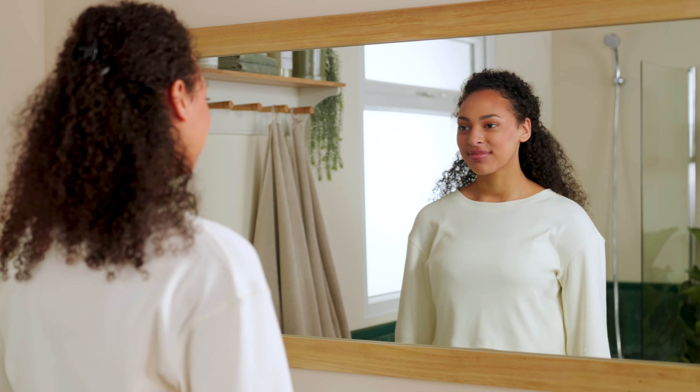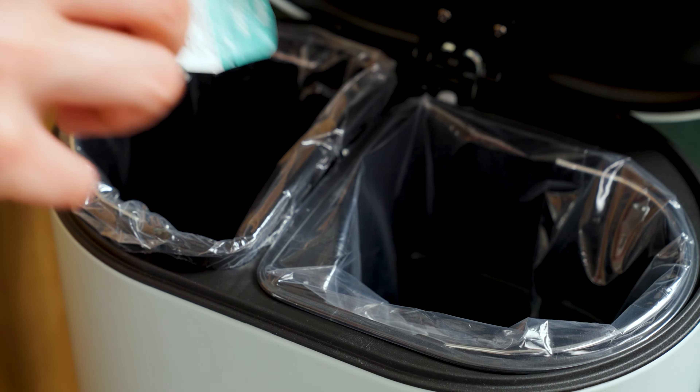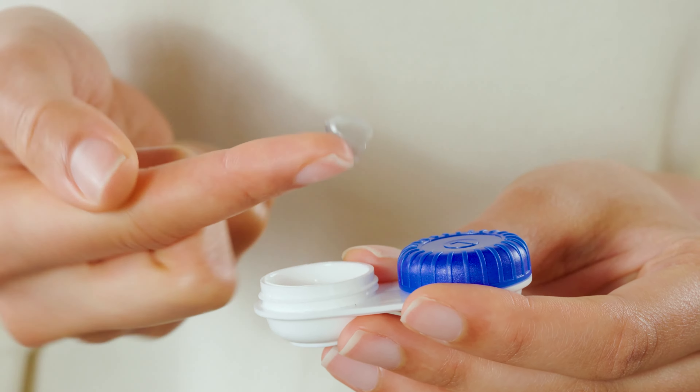Contact lenses usually work really well, but from time to time they may feel uncomfortable or gritty, which can be annoying. If so, there are a few things you can do. If you're using daily disposables, it's best just to throw the lens away and start again with a new one.